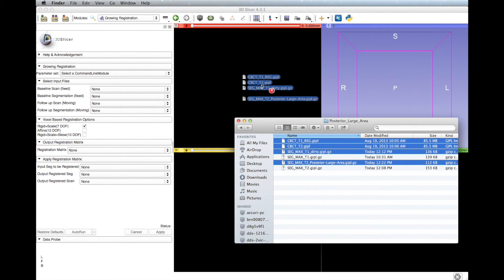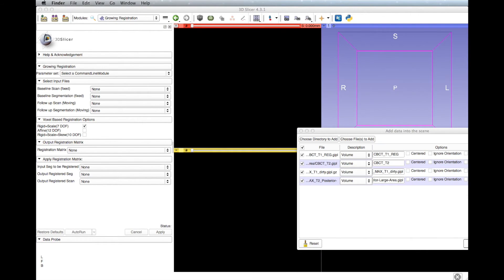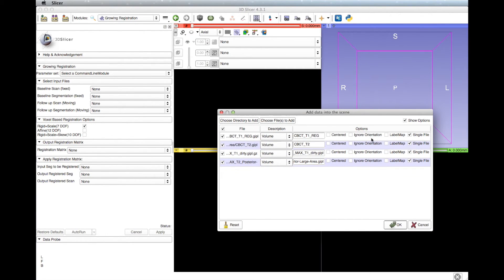Launch 3DSlicer and load the T1 and T2 scans, the T1 maxilla thicker segmentation, and the T2 maxilla posterior region of interest segmentation. Select the option Centered for all the files. Check Label Map for the thicker segmentation and the posterior region of interest segmentation.